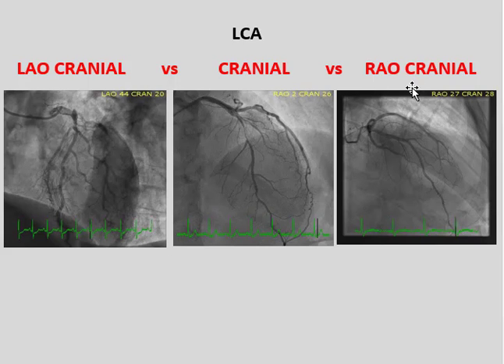And the RAO cranial is still that same view, the LAD up the front, but the detector has moved to the patient's right. These three looked at together, I hope, clarify that rotational aspect and that cranial angulation that separates overlapping vessels. Don't worry too much though. You will gain much more experience when you see a few hundred of these live in a cath lab.